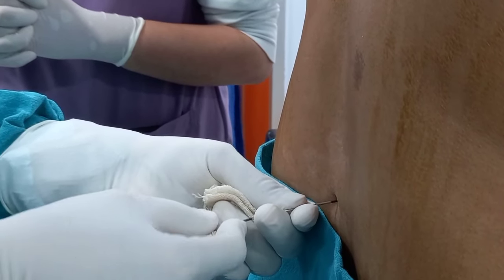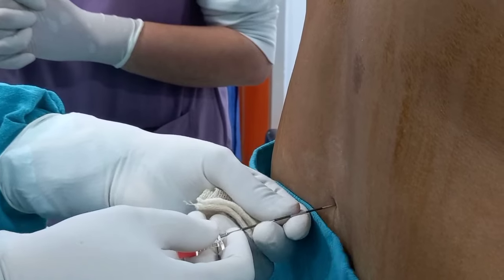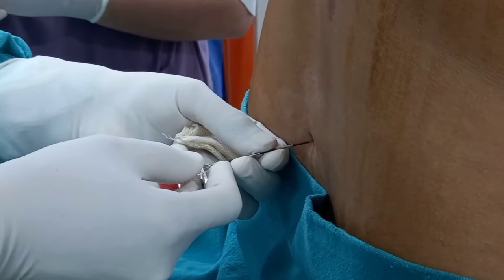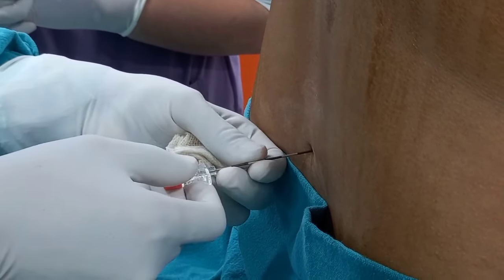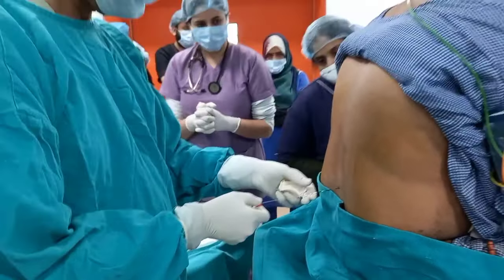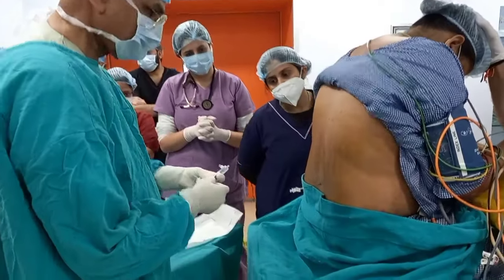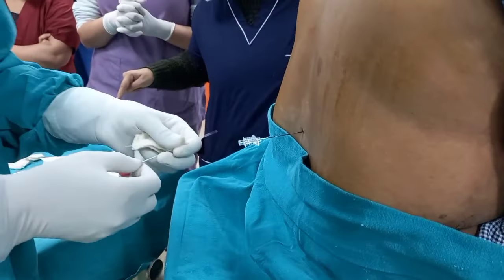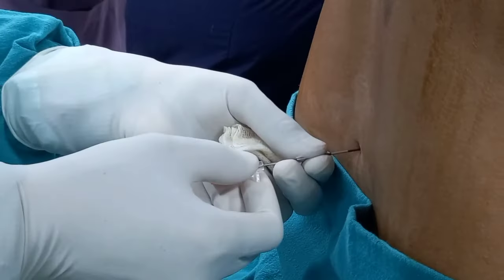All like equipment should be ready for painting and draping. Locate the puncture site and local infiltration. Then advance the epidural needle slowly into the interspinous ligament towards the ligamentum flavum. Remove the stylet and connect the saline-filled 5 ml syringe with balloon.